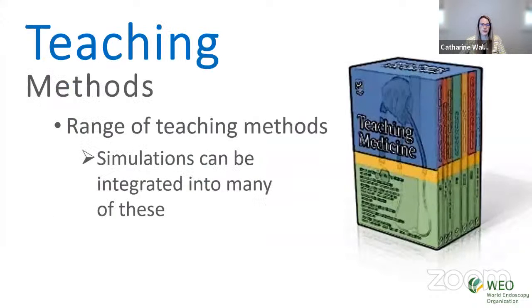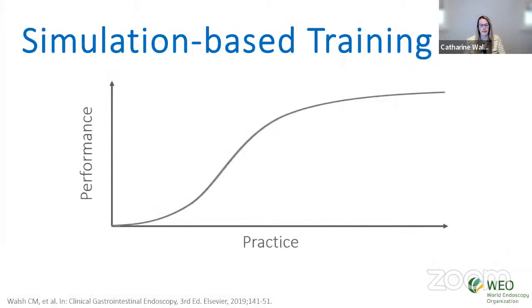In thinking about endoscopy, there's a huge range of teaching methods that you can use to teach endoscopy, and simulation can be integrated into many of these. This is just a basic learning curve, and for anybody learning a new clinical skill, simulation-based training is often becoming an integral part, especially early in training or in learning new skills, as it allows people to practice in a safe environment without putting patients at risk.